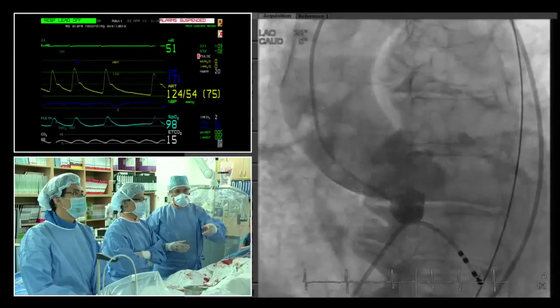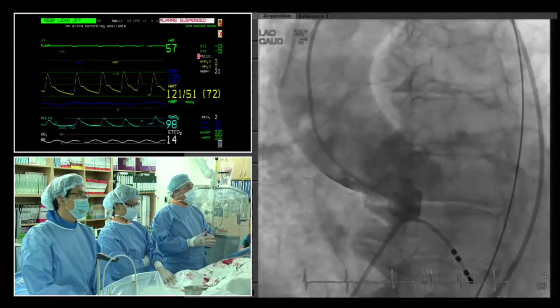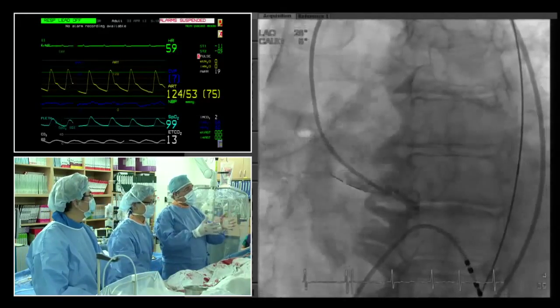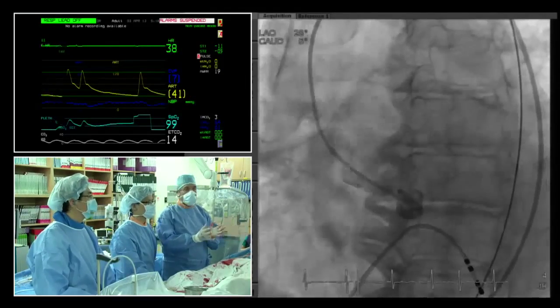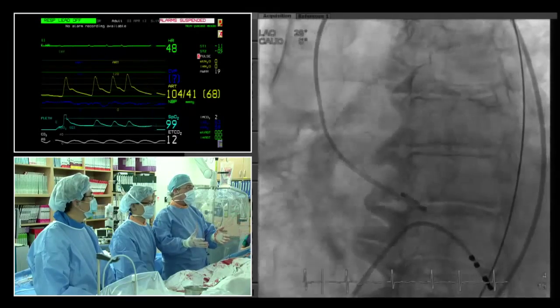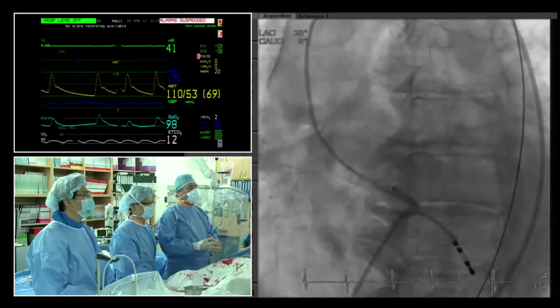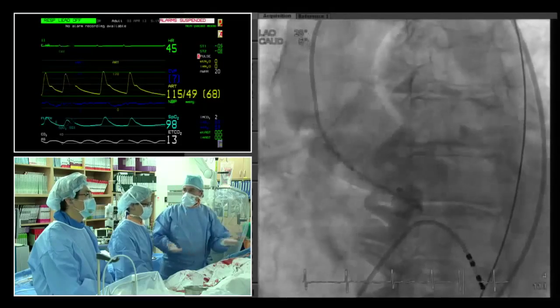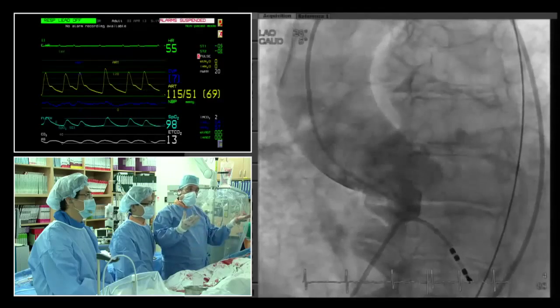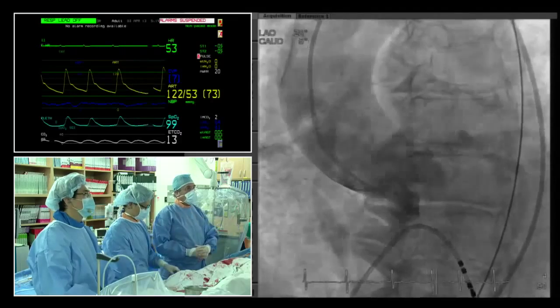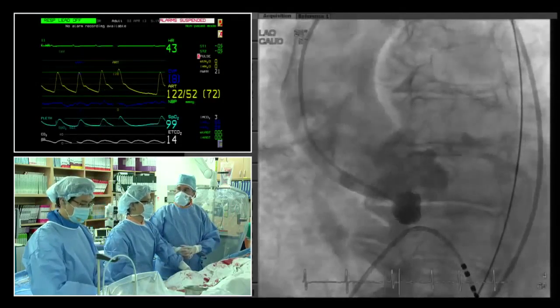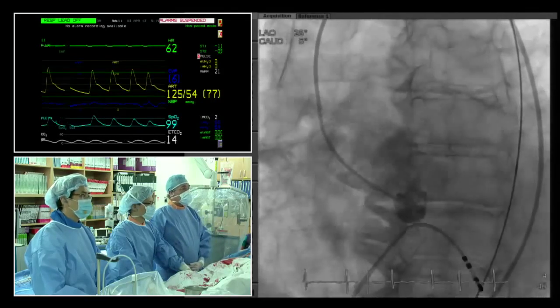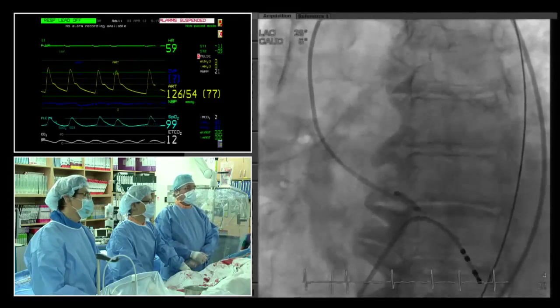For safety in this low-fixation setting, the plan is to pace the patient at the critical moment of implantation — similar to an Edwards case — pace, deploy two centimeters, then decrease and stop pacing once fixation is stronger. This approach is reserved for cases with minimal calcification; yesterday's heavily calcified case did not require it. Pacing prevents the valve from jumping during a long diastolic phase, especially with a 26 valve in a 22 mm annulus.